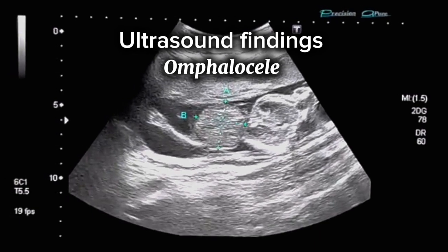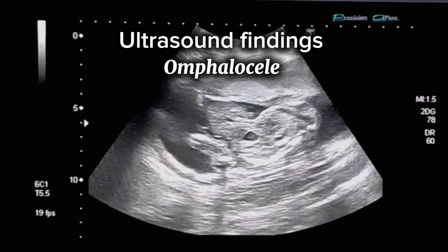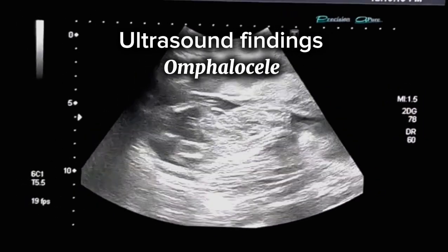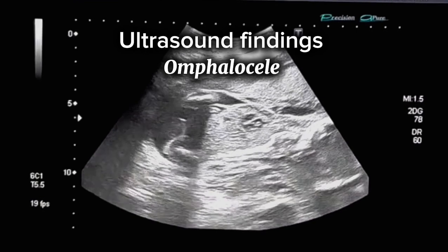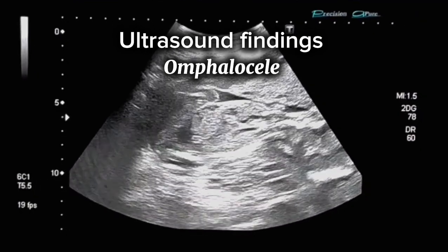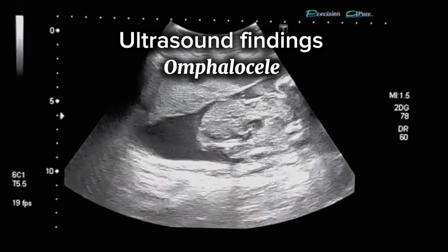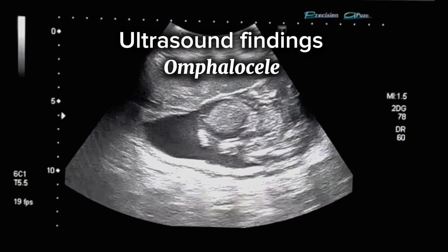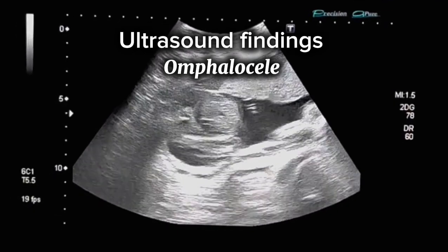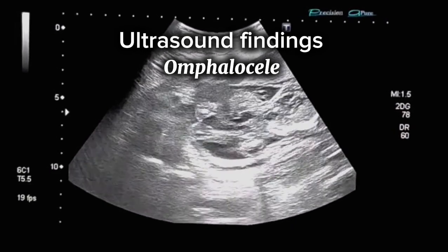The provisional diagnosis in this case was omphalocele of bowel loops only, fetal ascites, and bilateral clubfoot. Differential diagnoses include trisomy 13 or 18, which are commonly associated with omphalocele and limb anomalies. Syndromic associations include musculoskeletal or genetic syndromes.